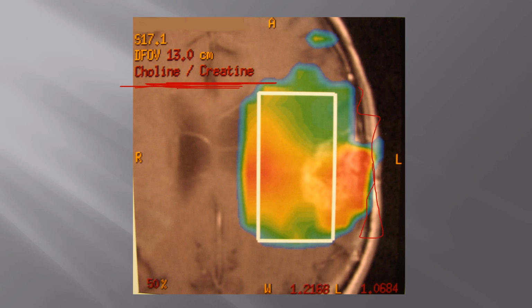So don't run your spectroscopy in the calvarium, and also try to avoid the ventricles if you can. Probably best, you'll get a better spectroscopy if you avoid the ventricles. So here we're looking at a choline creatine ratio, and you can see within the lesion this is very elevated, and also you have some elevation in the white matter, so you have this really infiltrating change in this case.